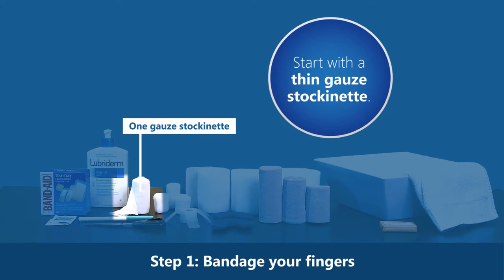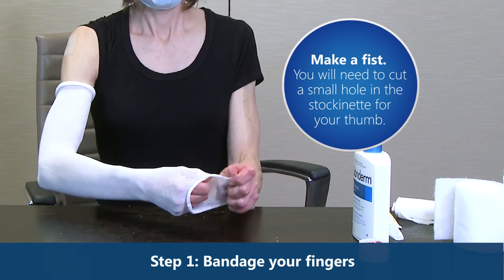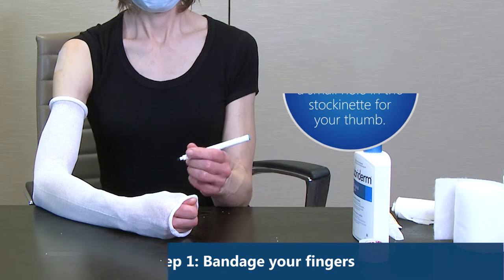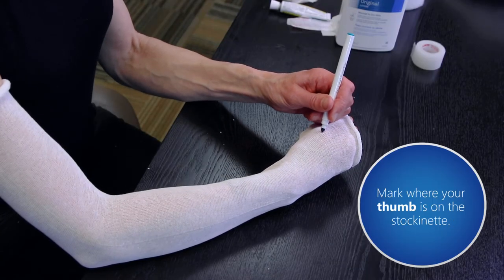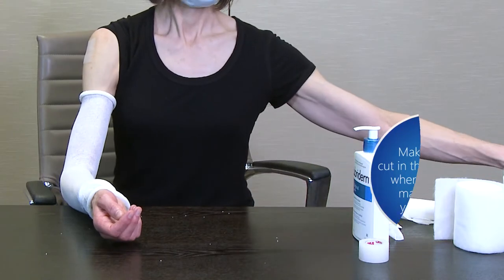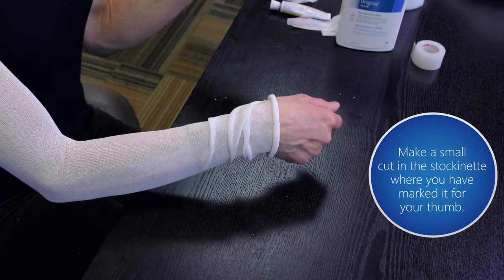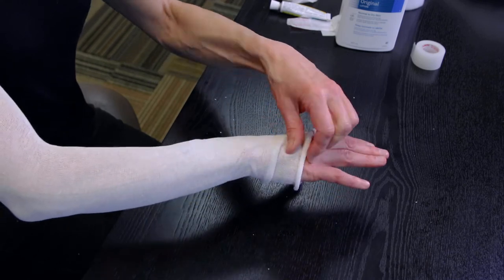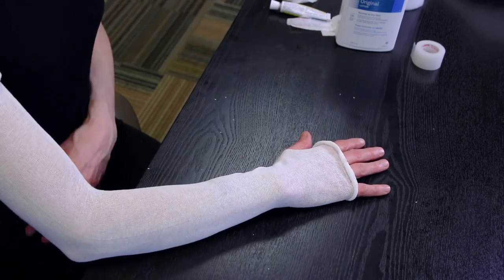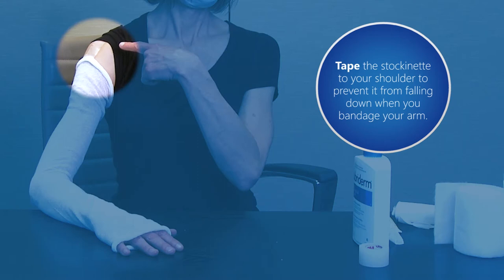Start with a thin gauze stockinette. The stockinette helps to protect your skin and should be washed after every use. Make a fist — you will need to cut a small hole in the stockinette for your thumb. Mark where your thumb is on the stockinette with a pen or washable marker, then pull the stockinette back and make a small cut where you have marked it. The stockinette will cover your arm just below your underarm to just below your knuckles. You can put a piece of adhesive tape such as paper tape on the stockinette and tape it to your shoulder to help prevent it from falling down when you bandage your arm.